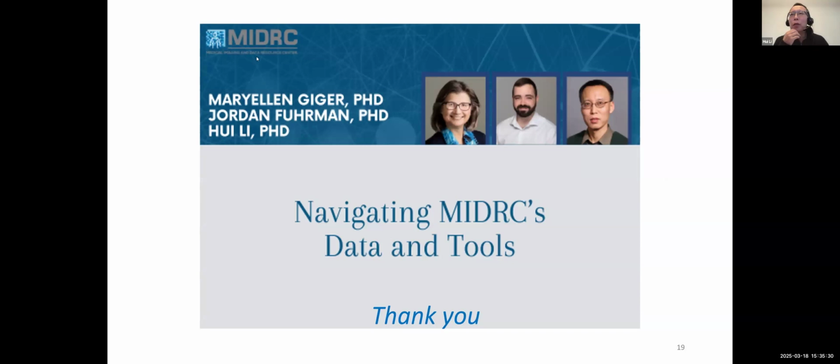Yep, I can jump in a little bit. So I personally use them, and if you go to the MIDRC GitHub, the README file and the instructions are very clear, and then you just follow the instructions to download, and then it's very easy to use. Yeah, and I've used especially the stratified sampling and REACT tools in my own work. Like I said, most of the input files are things that I already have. I would suspect most people have some kind of table with case IDs and all the attributes that are relevant.